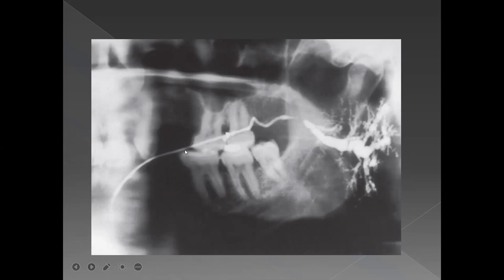This is that catheter. So over here is the entry point. Here is the parotid papilla, if you would say, and here is the rest of the duct. And is there anything you can see over here?